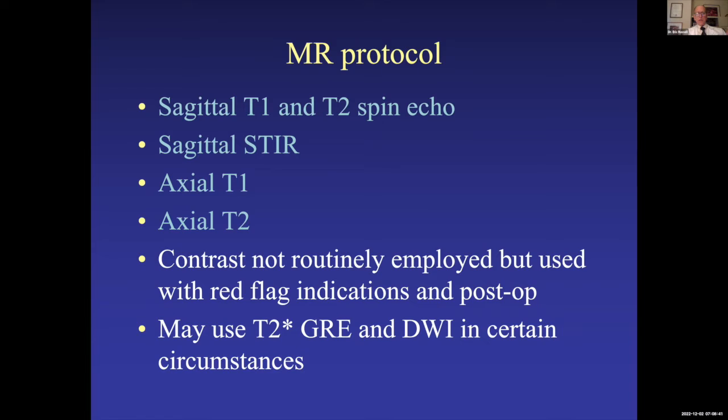weighted STIR sequences. The STIR sequence is very sensitive to fluid, so edema in the bone, changes in the spine, the spinal cord, the nerve roots are best seen on STIR, short TI inversion recovery. And then we do axial T1 and T2. We don't routinely use contrast. We'll talk a bit about the use of contrast for low back pain as we proceed.